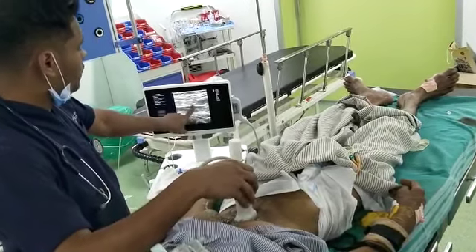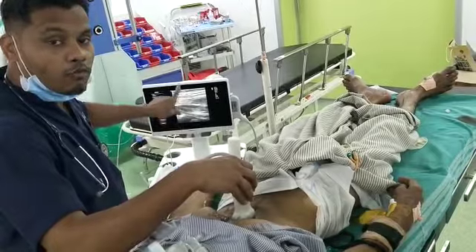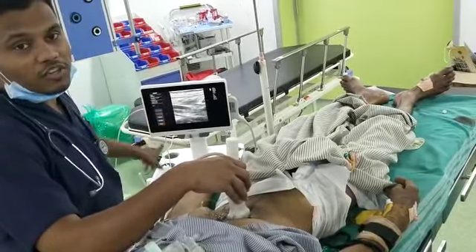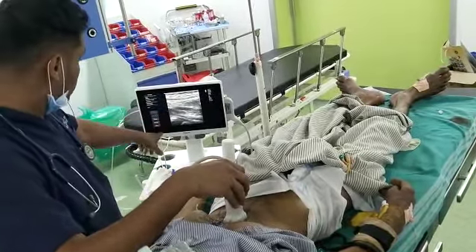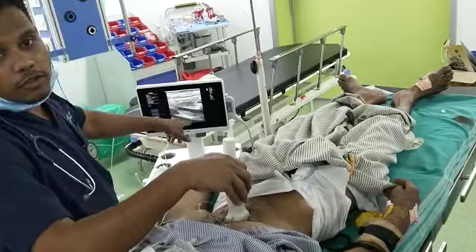This is the IVC. It is more than 1.5 cm, which means our patient is well hydrated. Thank you so much.